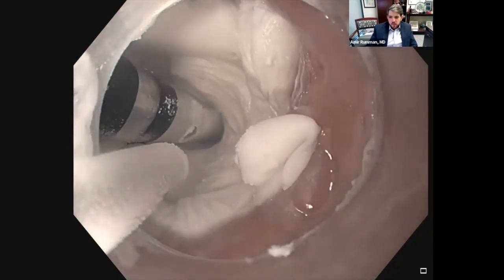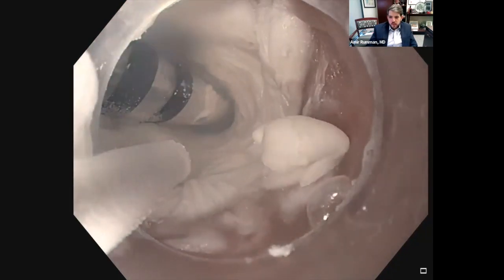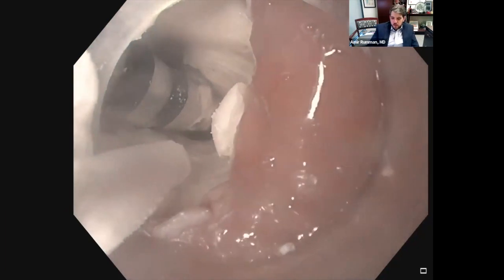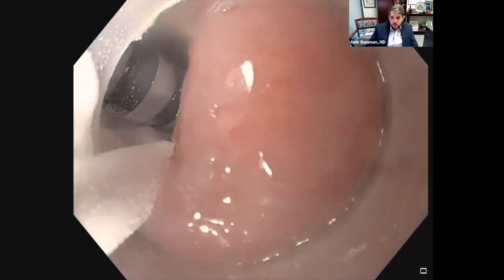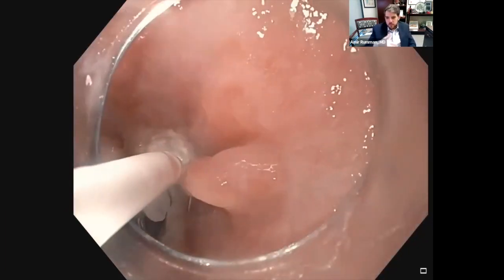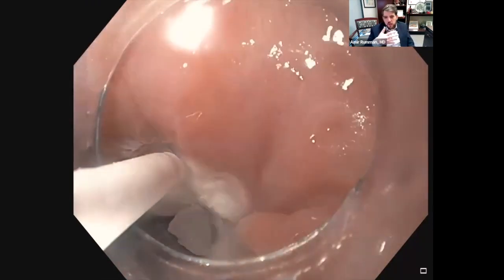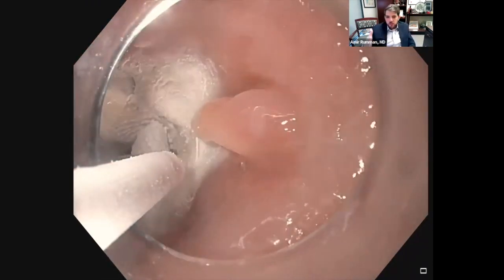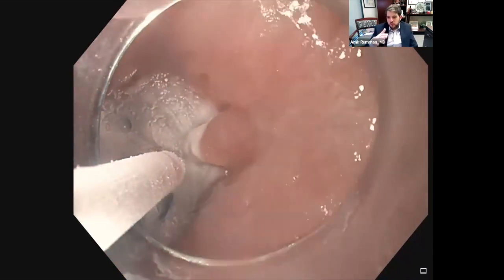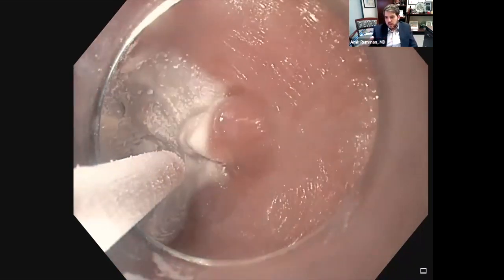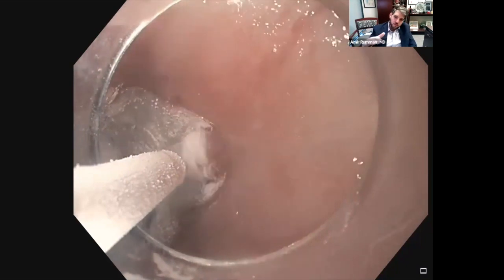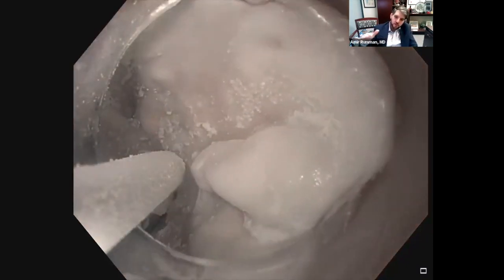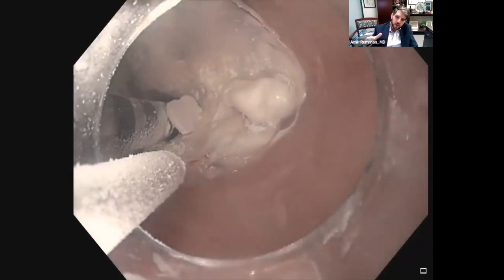If you look at this four o'clock position, that nub of tissue over here — this is a nice example of preferential scarring. This patient had multiple balloon dilations, and if you look at all her historic pictures, the mucosal rent, the tear, is almost always in that direction. There is some intrinsic weakness in that side of the wall, and that's where she preferentially tears with these balloon dilations.